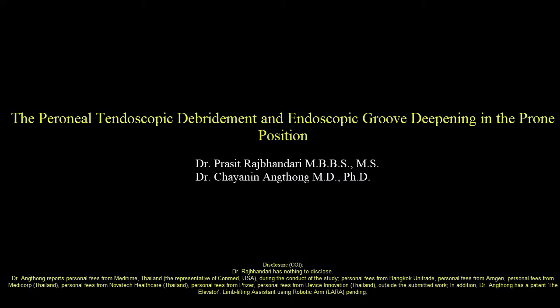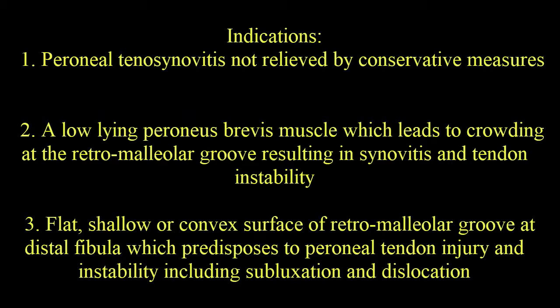Here we present a case of peroneal tendoscopic debridement and endoscopic groove deepening in the prone position. The indications are peroneal tenosynovitis not relieved by conservative measures, a low-lying muscle belly of peroneus brevis, and a flat, shallow, or convex surface of the retromalleolar groove.